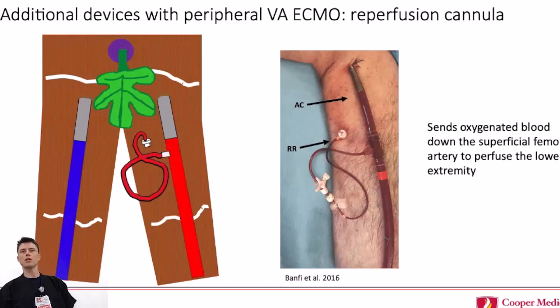So you may only have a mean arterial pressure because it's just continuous flow going down to the foot, not pulsating. I know a lot of times you have Doppler checks built into your protocol, but you wouldn't necessarily expect a Doppler pulse because you have just laminar flow.